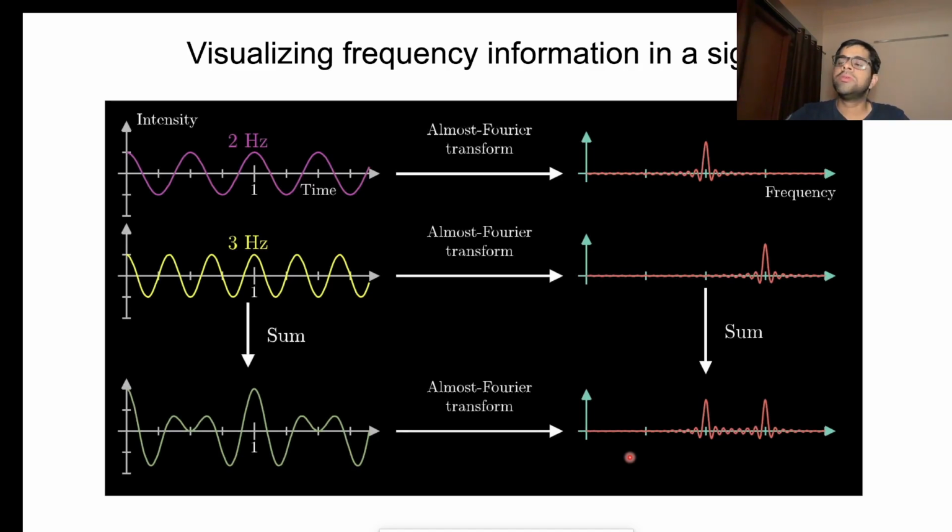You get a better idea instead of just analyzing the time and values. Seeing a peak after a stimulus, but seeing that peak in what frequency. If you do a Fourier transform, then you see what particular frequency is changing, and you can say much more about the stimulus and the state of the brain.